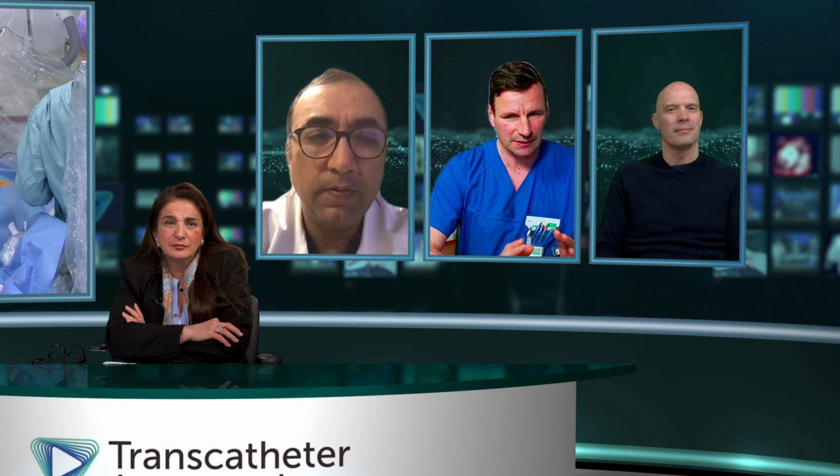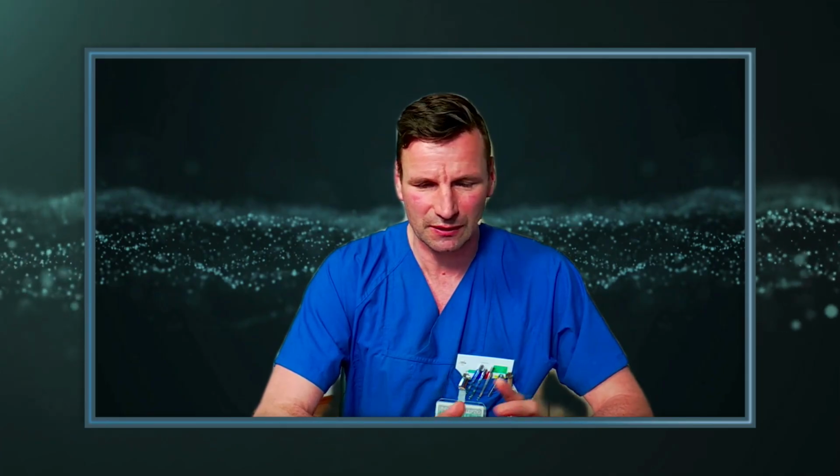It's nice to see it, but I'm not sure if general CT imaging before is really required, and I don't think that we will really improve the outcome and maybe the procedural results by using CT. It's nice, and it's also nice to have 3D printing, but I think for the majority of patients, it can easily be done with TOE.